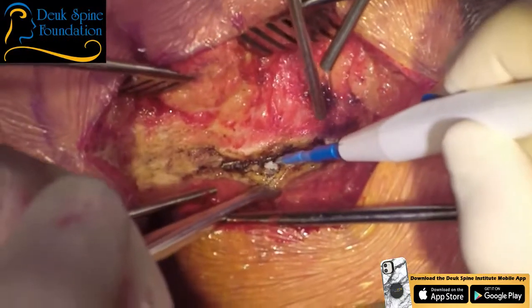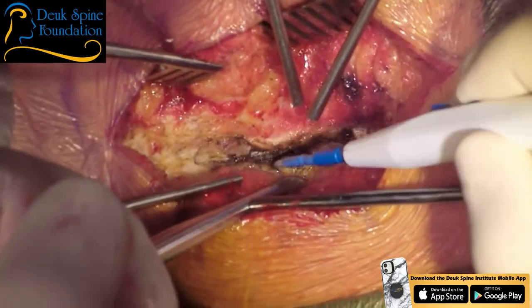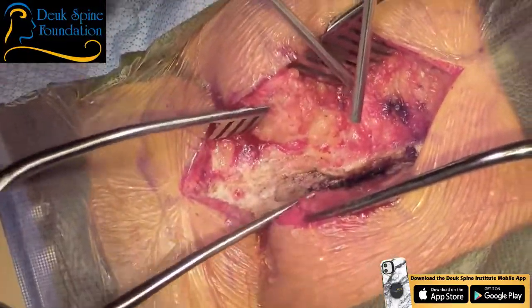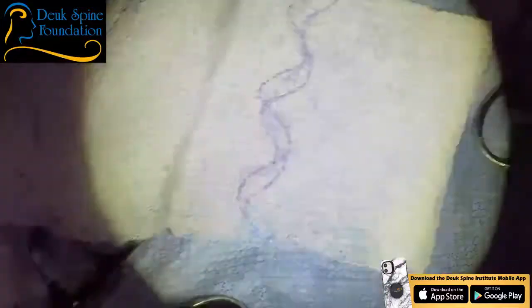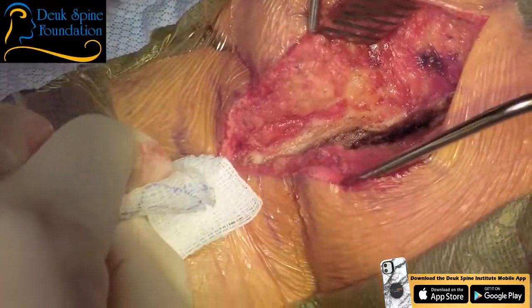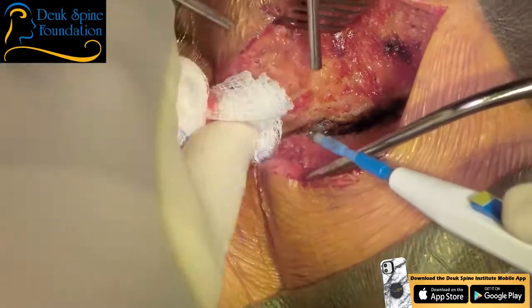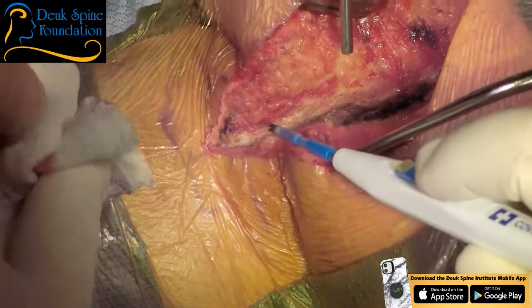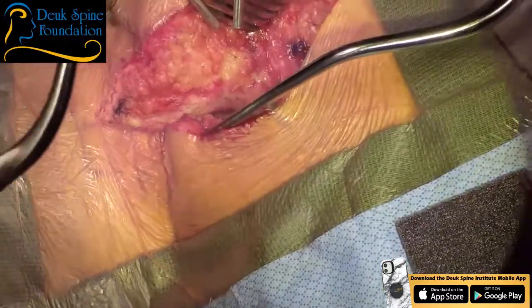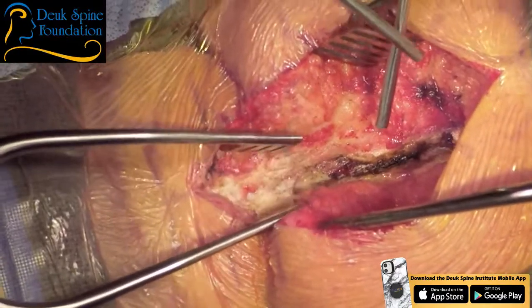We have a question from our audience. Sure. One of our viewers is wondering, what are you doing right now and what are you trying to repair? So what I'm doing now is we're in the back of a neck and we're trying to repair the cervical spine. This patient has multiple disc herniations causing narrowing of the spinal canal where the spinal cord and nerves are. So the spinal canal and the foramen. So the nerves and spinal cord are getting pinched and as a result she's developing nerve dysfunction called radiculopathy and spinal cord dysfunction called myelopathy. Developing two problems, radiculopathy, myelopathy, and she also has pain as a result of deformity that she's developing, which is scoliotic deformity.